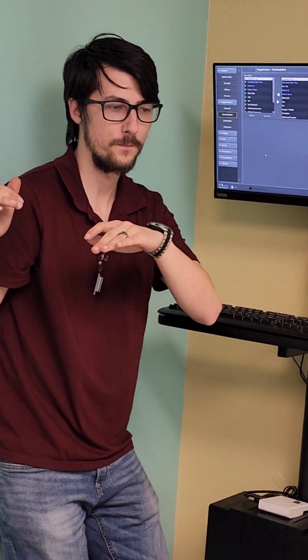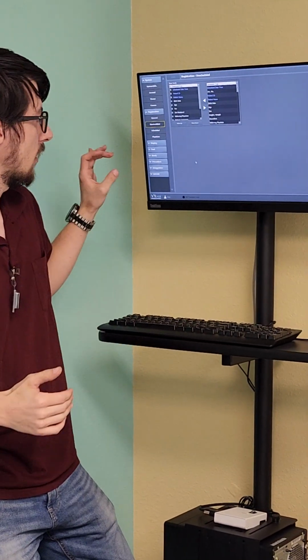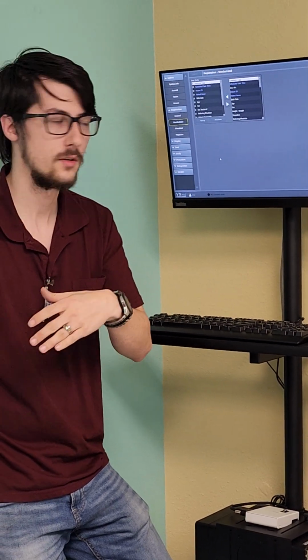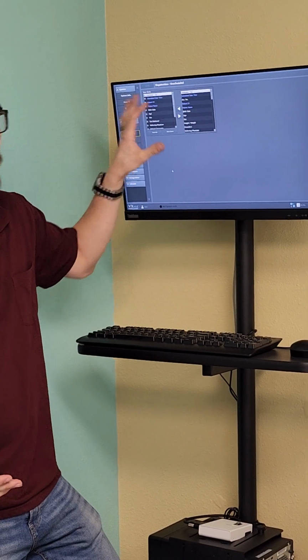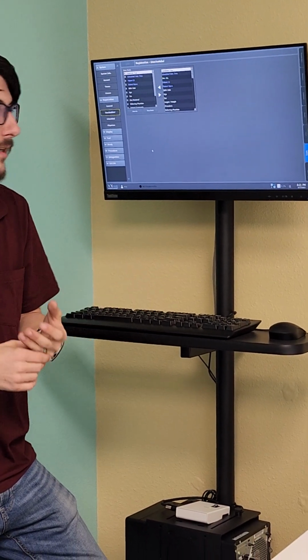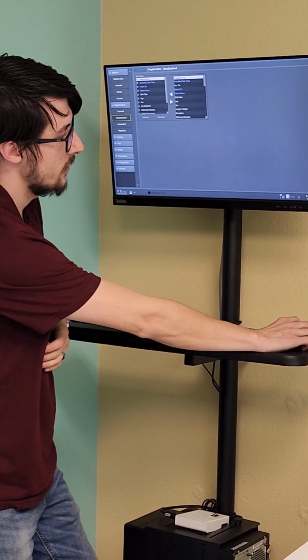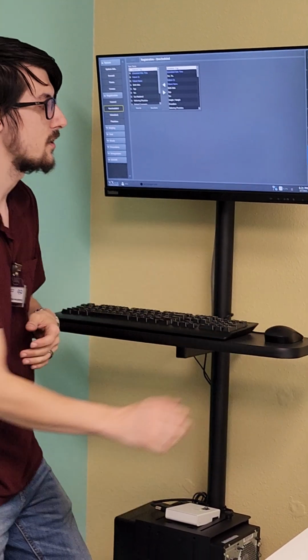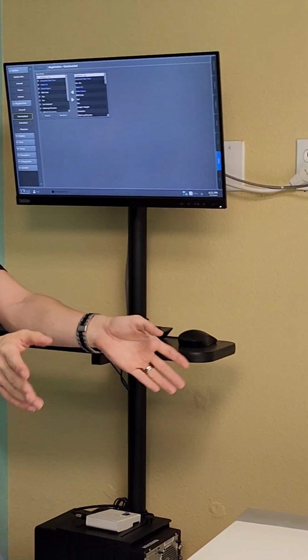There is a service login that has other stuff in there that y'all wouldn't have to touch. I'm just letting y'all know that some settings aren't accessible through here. You would have to call service, and then you would have to access that. And then down here, these two computers just mean your computer is talking with your panel, your X-ray panel.